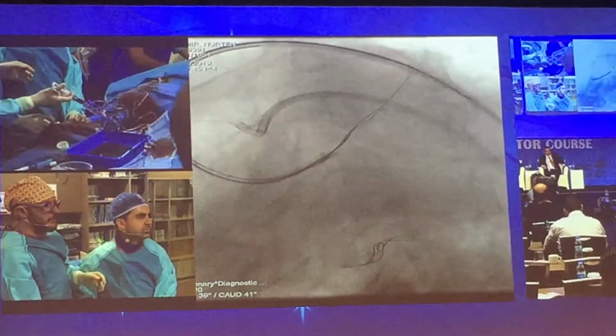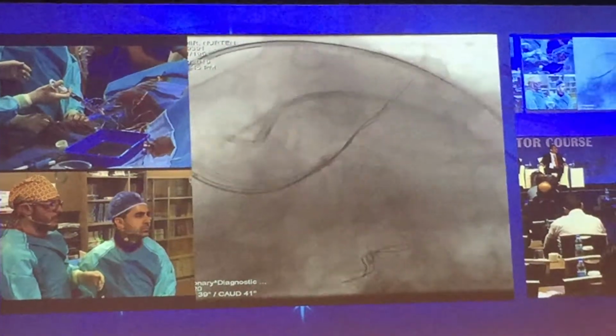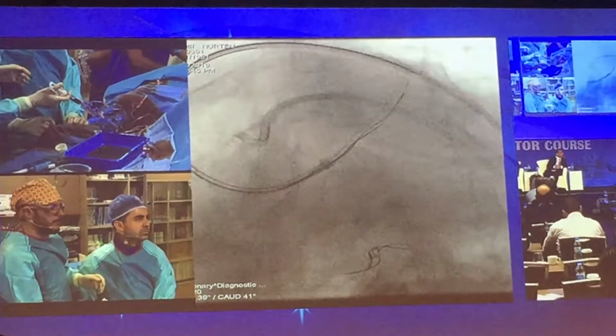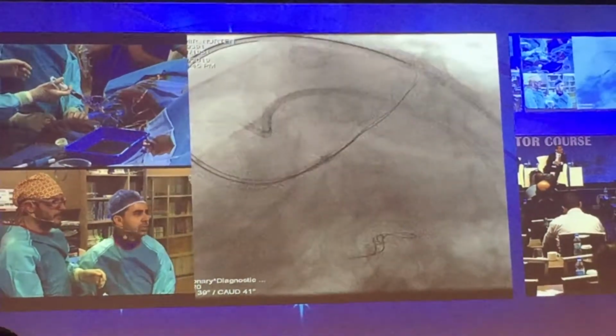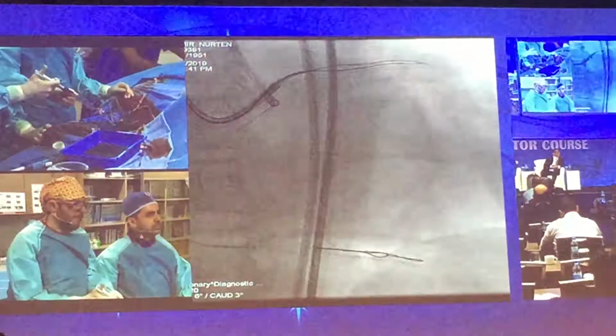Can you comment on, for example, the calcification status of this patient? We do not see any severe calcification on the CT scan. If the wire is going directly to the subintimal space, the chance of lesion calcification is high, I think. What do you think about that?